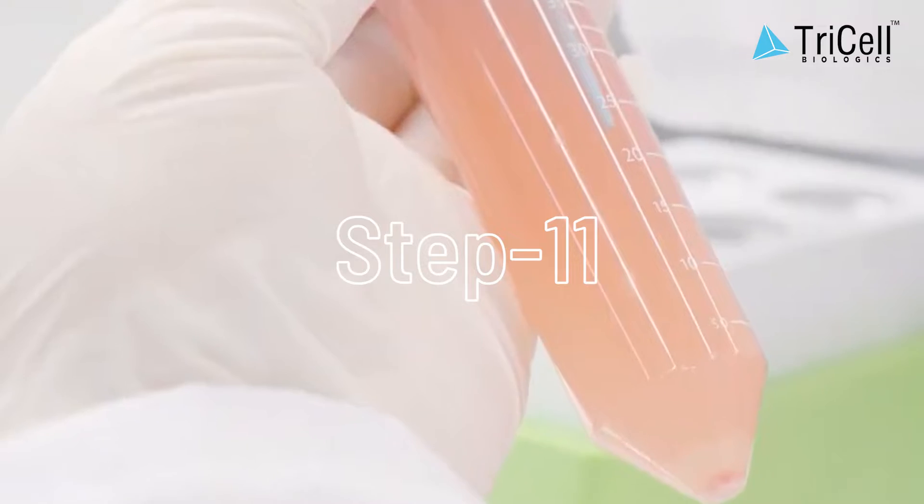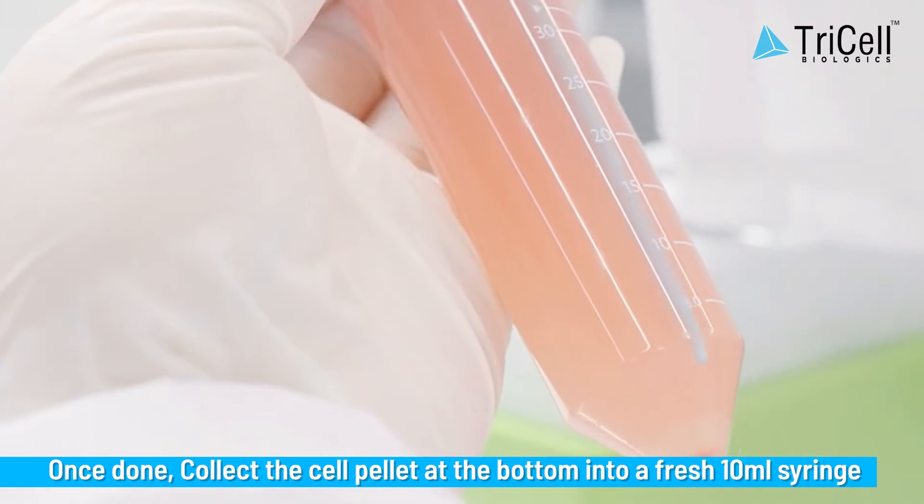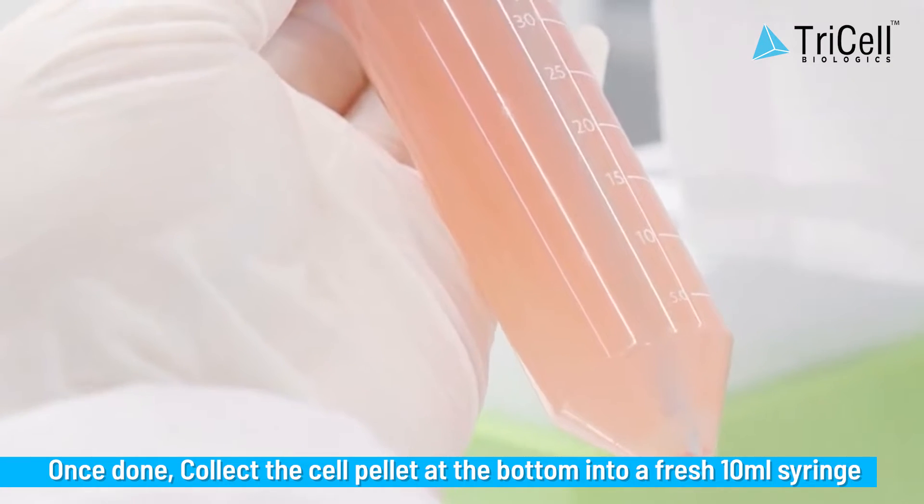Step 11: Once done, collect the cell pellet at the bottom into a fresh 10 milliliter syringe.